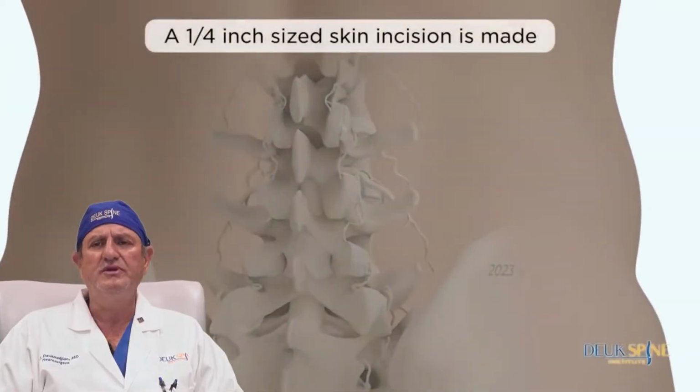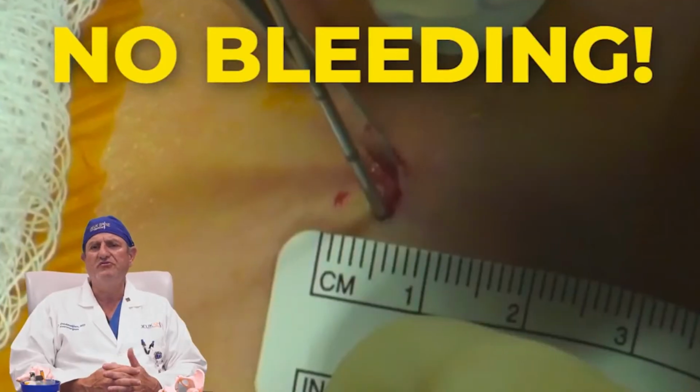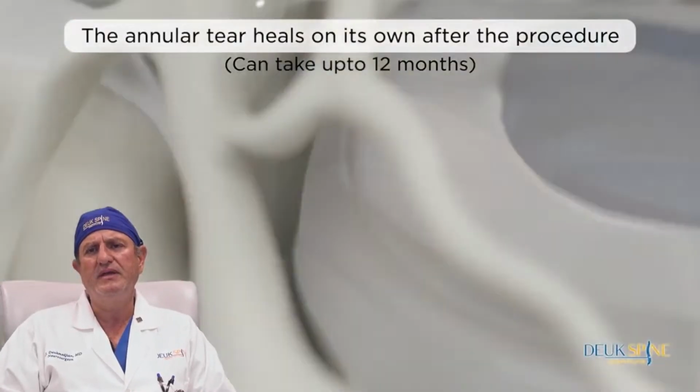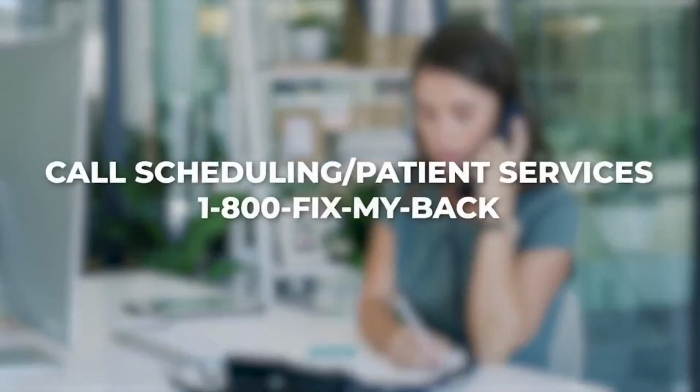Our patients are treated with a small 7mm incision. That incision has minimal to no bleeding, and it heals within a few days. There is no need for narcotic painkillers. If you have the Deuk laser disc repair, we can fix the back pain coming from your damaged disc within 3 days. We recommend you talk to our schedulers.